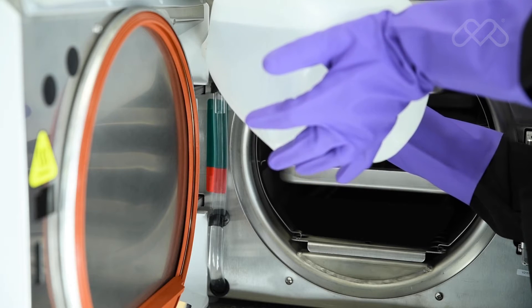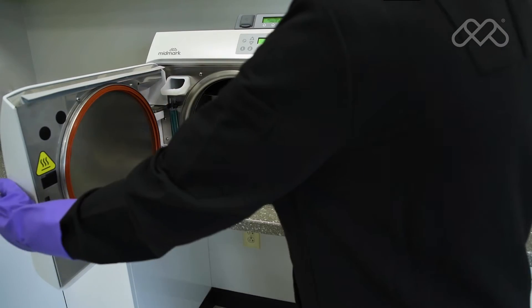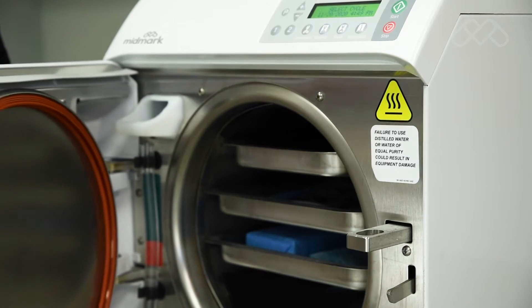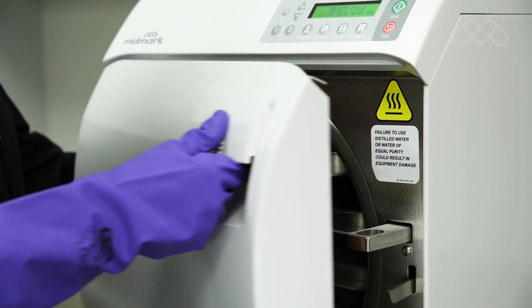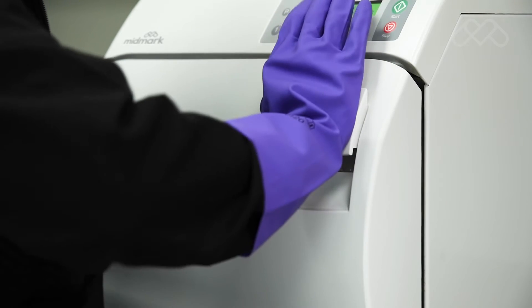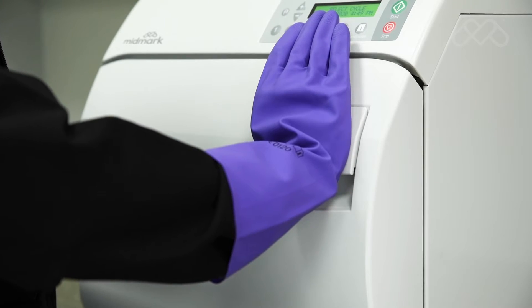After verifying that the sterilizer has adequately filled with water and has been loaded properly with sterilization items, close and seal the door. Closing and sealing the door is done by lifting the door handle and pushing the door closed. Once the door is closed, gently push inward on the door while sliding the door handle downward to engage the latch.